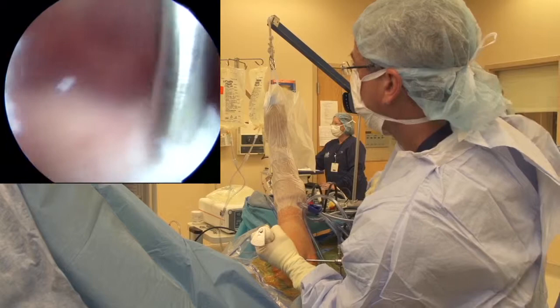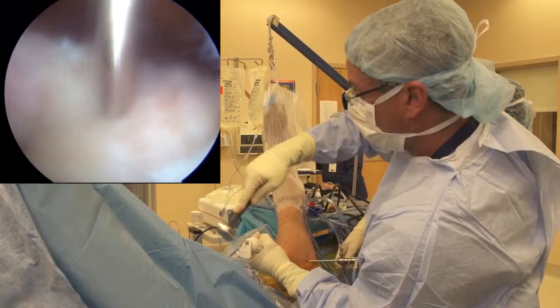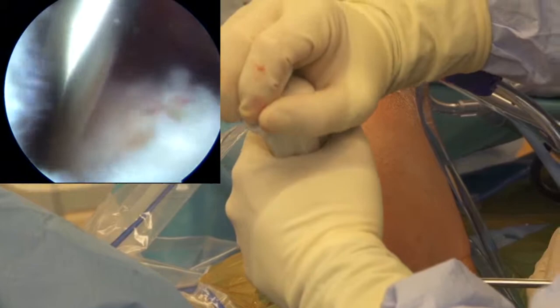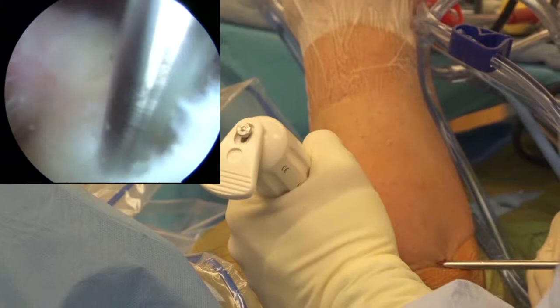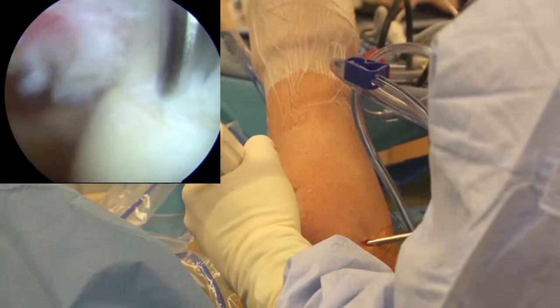As a general rule, if we can do it about every three millimeters or so, that's about the amount of space we're looking to achieve. What's awesome about this device compared to a standard chondral pick is that it's only one millimeter in circumference versus a standard chondral pick which is about three millimeters. It's also got about a nine millimeter depth compared to three millimeters for a standard chondral pick. That extra depth gets you down into that marrow cavity, hopefully stimulating some pluripotential cells to come out. It's very simple - just push up on the chondral pick and out it comes. We're going to see if we can just get around the corner here down to the articular margin.